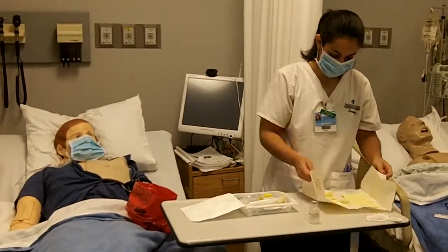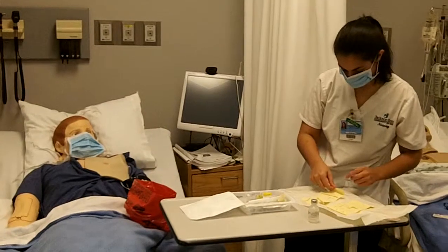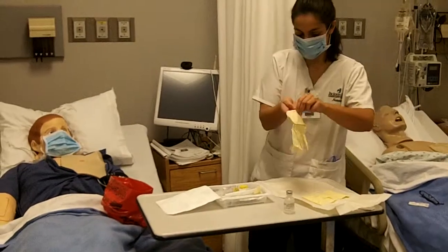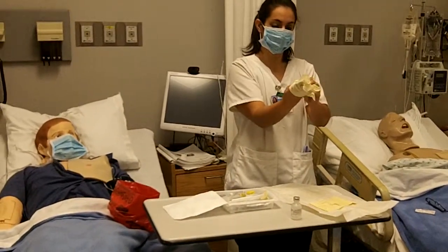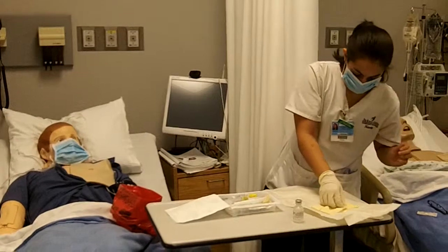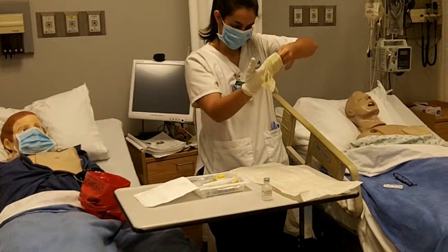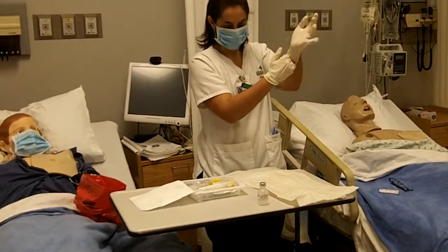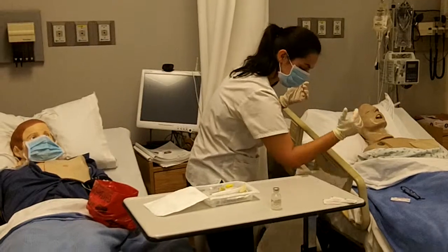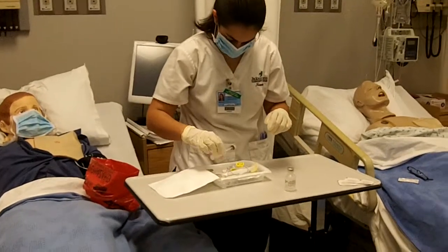Donning my sterile gloves, I pinch the cuff and I would grasp underneath this cuff, watching where my fingers are at all times. Now put that in the trash. Okay.